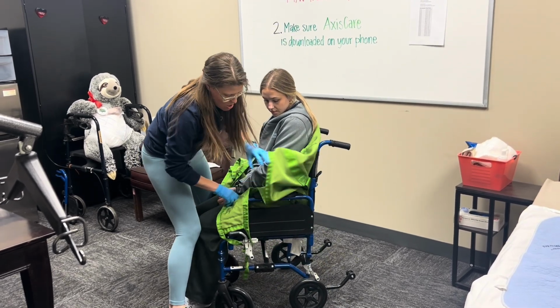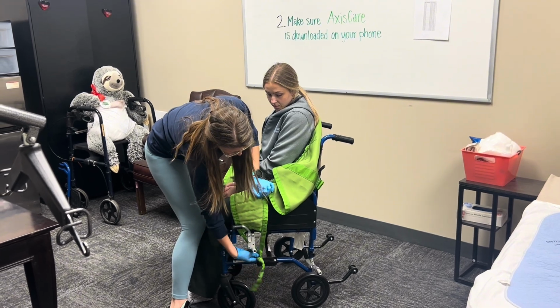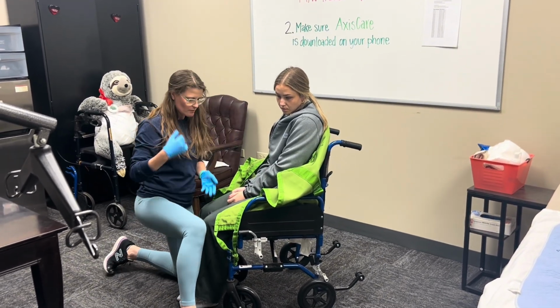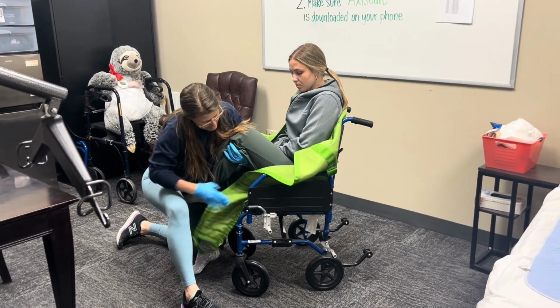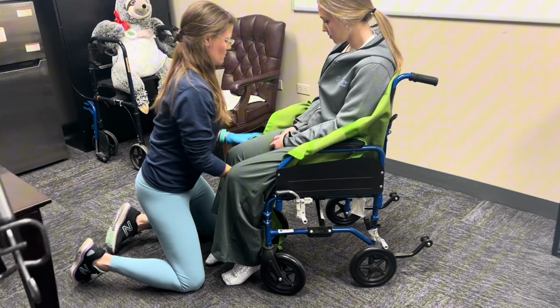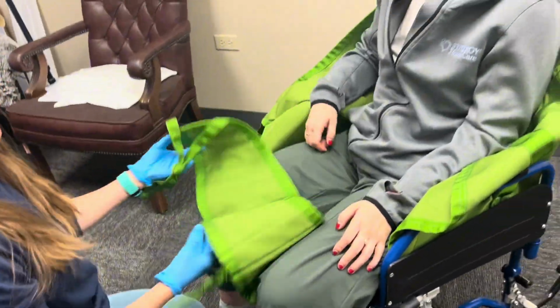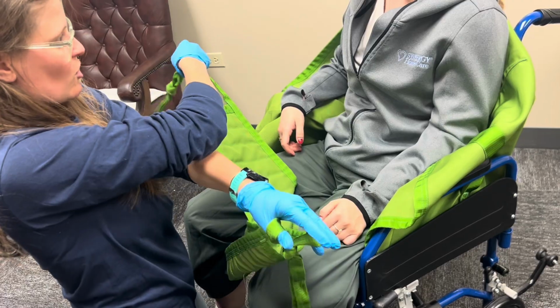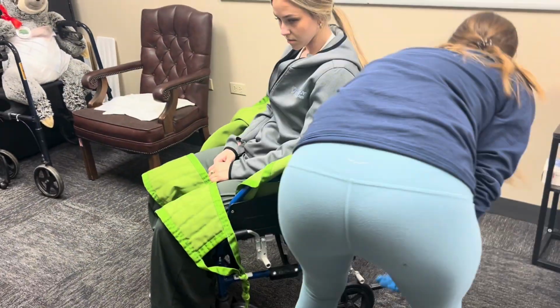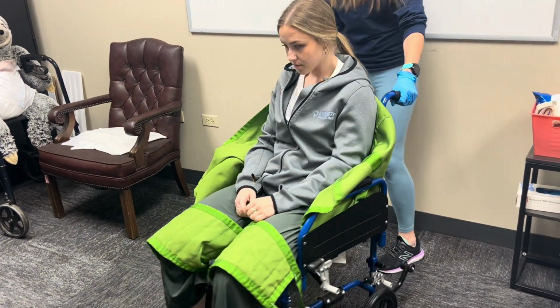Some clients are more mobile than others. If our client is very big and non-mobile, it is probably advised to keep the sling in from an ease standpoint. So now what I'm going to do is lift up her leg and pull that underneath. I'm going to lift up this leg and pull this one underneath as well, so that I have the leg pieces that will crisscross applesauce. So sitting here, I'm going to just move the wheelchair from a visual standpoint.